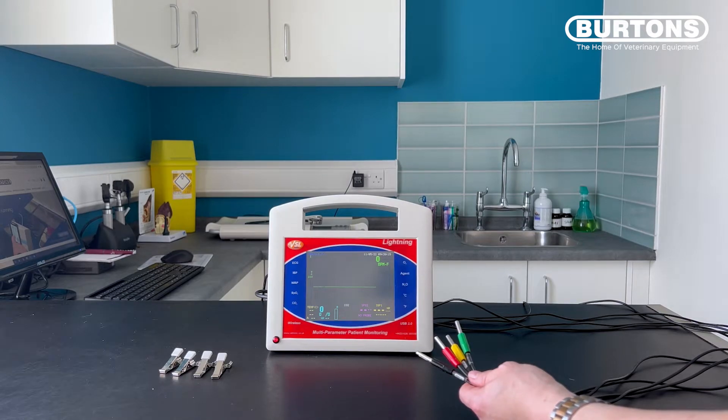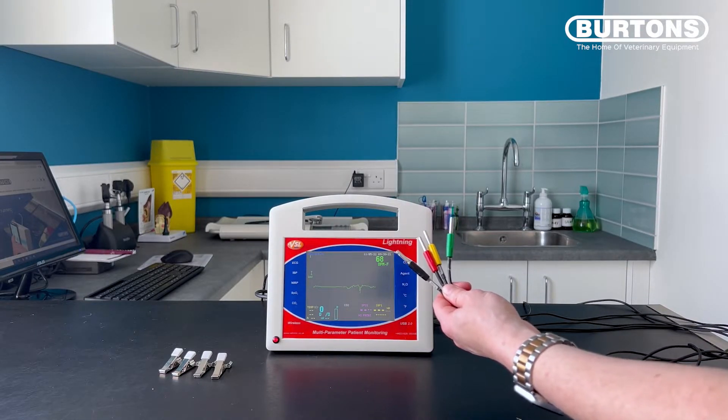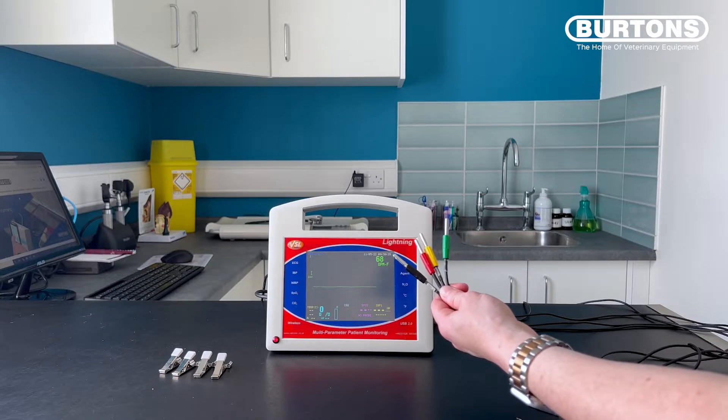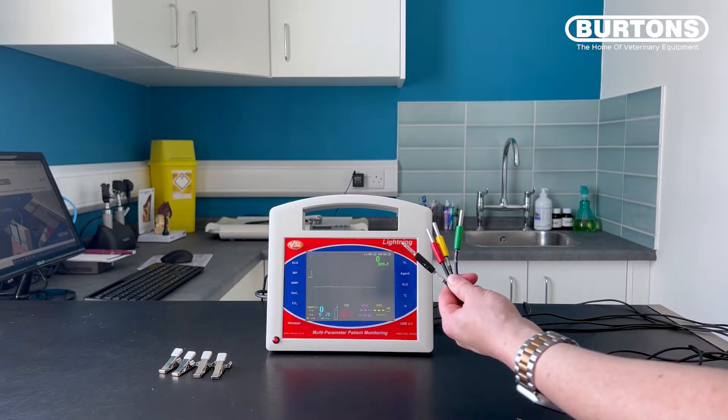This second test allows us to make sure that each cable is working correctly. What you want to do is pick them up and hold them in one hand without any of the electrodes touching. I have removed the crocodile clips for this test and just exposed the banana plugs. In leads one, two and three, the active electrodes are red, yellow and green. The black electrode is purely for reference or for grounding.